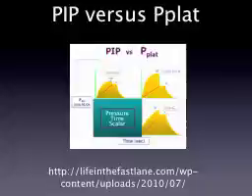Okay, so let's just talk real quickly about the PIP versus the P-plat, and I actually had a video where I covered this, and I linked that video to the first playlist on introductory mechanical ventilation. But basically, if you look over here, I know I haven't gone over ventilator graphics, but this is one of the graphics. This is called the pressure time scalar, and this is a waveform.